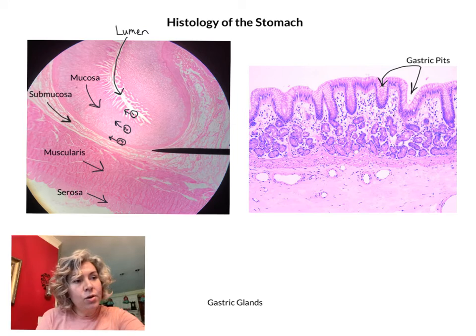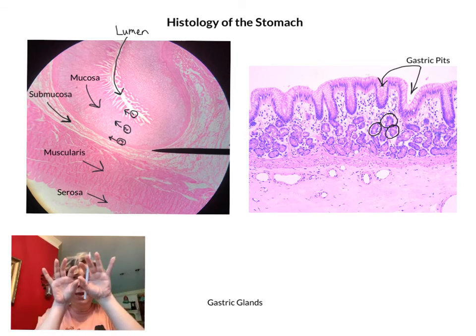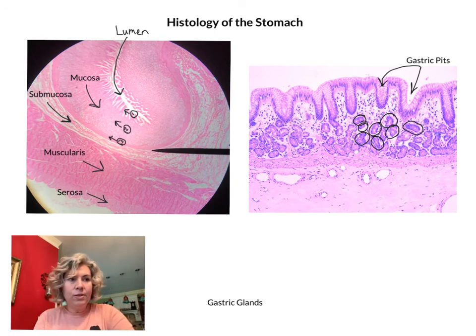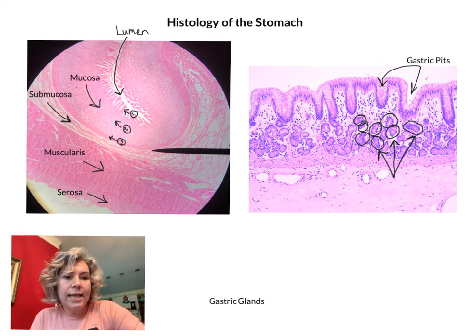These gastric glands are these cuboidals that you see. If you remember from AMP1, I usually compare cuboidal epithelial tissue to donuts, because there's typically an apical or free surface in the middle, and then the epithelial cells form a circle around it. So if you look real close, you can see these clusters of cells that almost look like little tiny donuts. These are glandular cells, made of cuboidal epithelial tissue. I circled several of them just to bring the clusters to your attention. We would call these gastric glands.